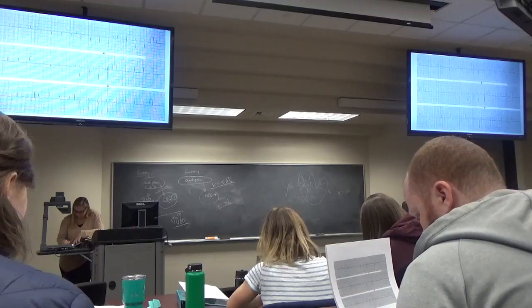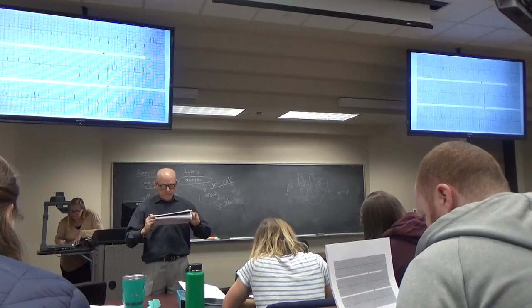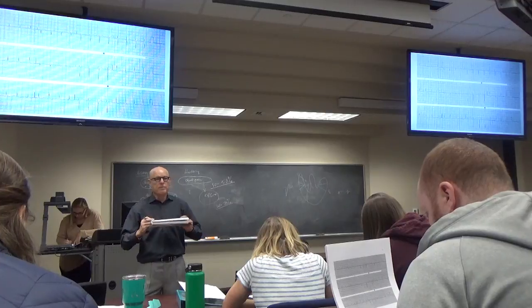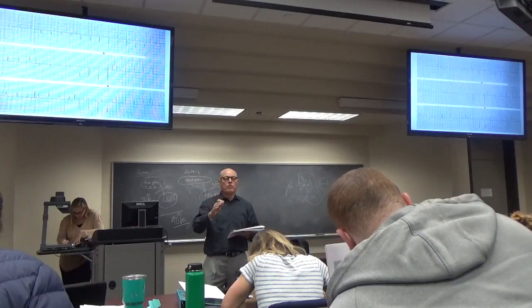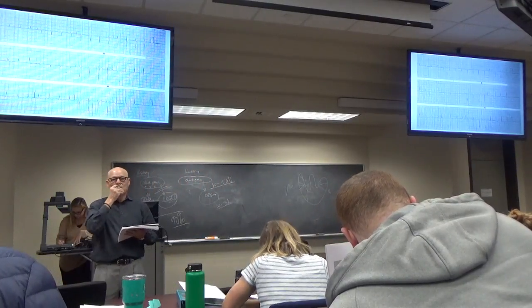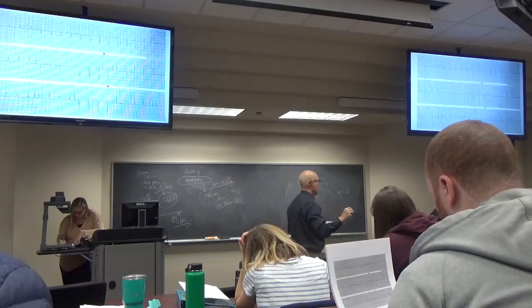I have a question. Yeah. Are there biphasic P waves in V1? Yep. I put that, because I put left atrial enlargement. Okay, that wouldn't be wrong. They're biphasic P waves, left atrial. So some people call it left atrial abnormality or left atrial enlargement. So that would be an appropriate EKG interpretation for the P waves in V1.